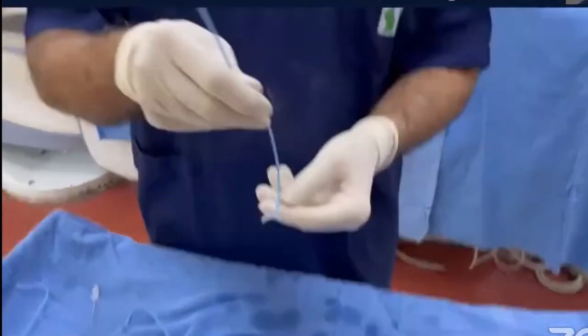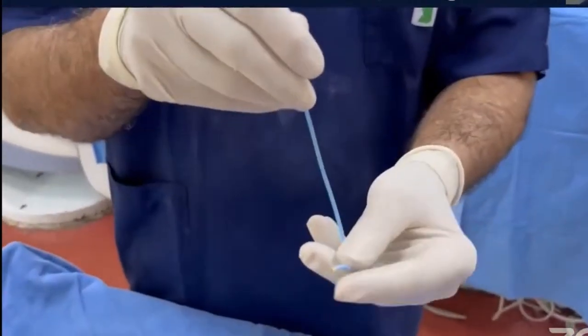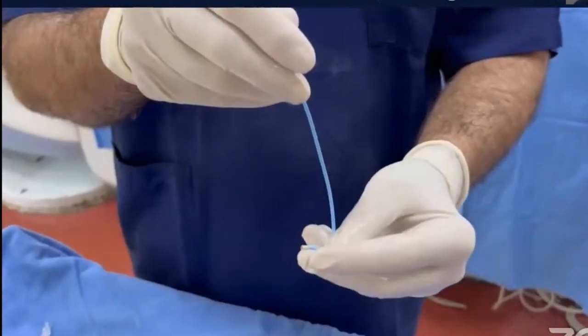But that's the only anomaly which is said to actually be easier through the radial in every publication, but the majority of the publications, case reports, etc., have all relied on femorals rather than radials. So you're talking about 90%, 95% of the publications actually being femoral approach.